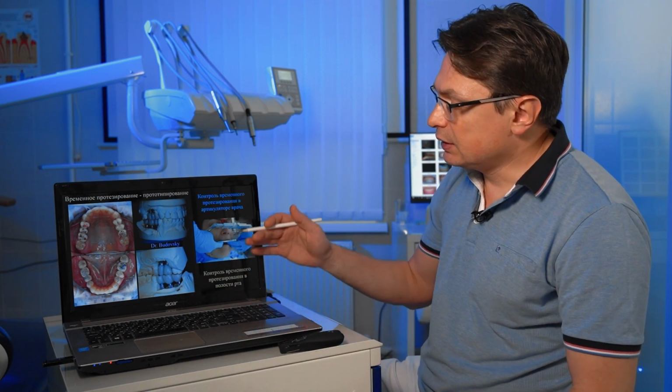But even if you have a very good technician, colleagues, you shouldn't blame the technician for everything. You have to make good casts, make the correct registration, name of work, give color, number, and so on, but that's not all. Colleagues, you have to build the patient's occlusal scheme, give data and settings of the articulator.